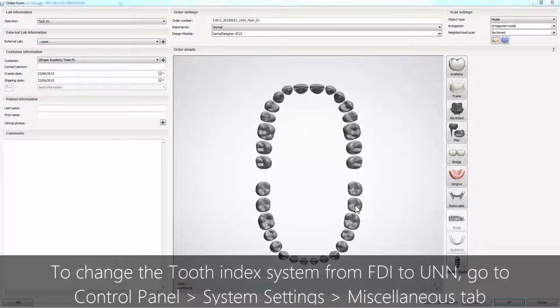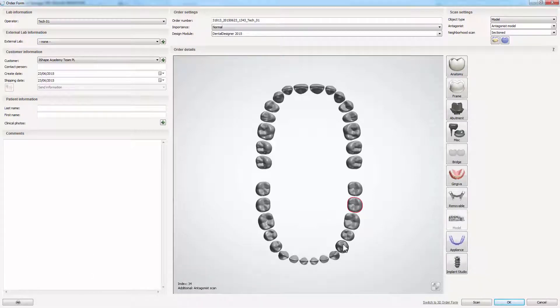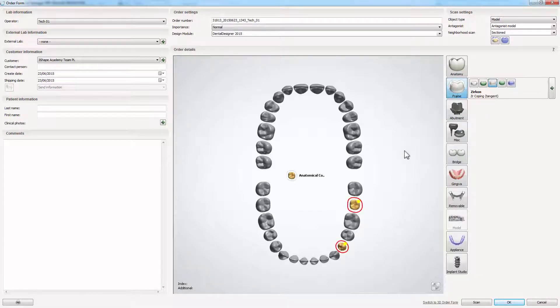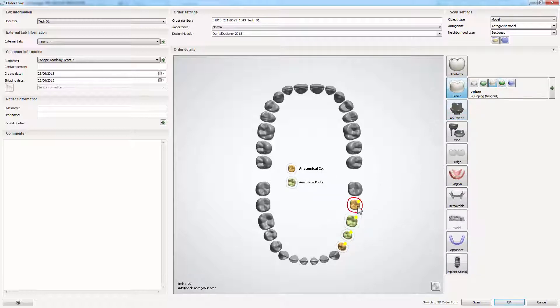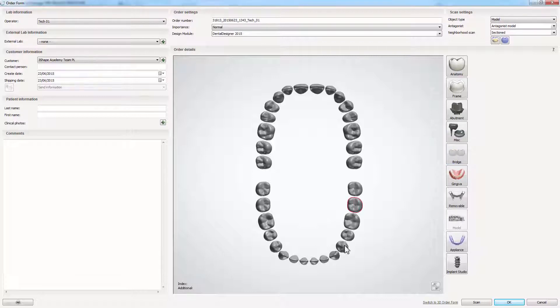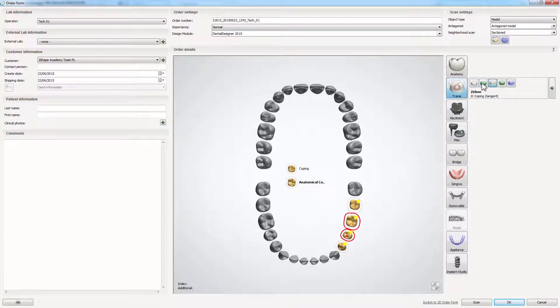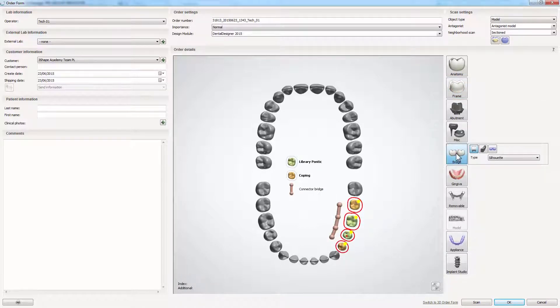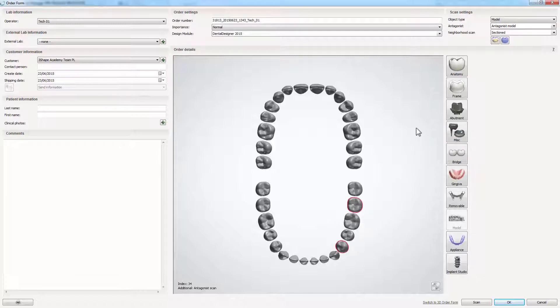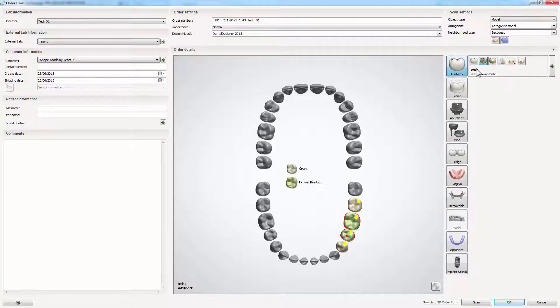Depending on your needs, you have three options. First, anatomical frame layer with anatomical coppings, pontics and connector. Second, frame layer with single coppings, pontics and connector. Third, anatomical layer with crowns, crown pontics and connector.